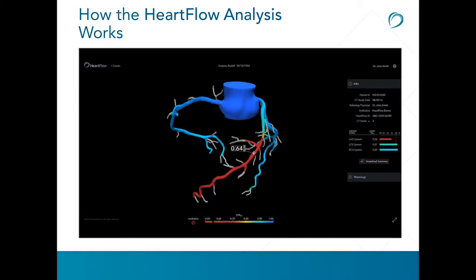A virtual pullback can be done just as would be done in the cath lab with a wire. Above that LAD stenosis the FFR-CT is 0.87. This is simply quantitative input allowing clinicians to determine the best management for a particular patient. It's a unique test because it's non-invasive and gives you information on both anatomy and physiology simultaneously — pretty extraordinary technology.